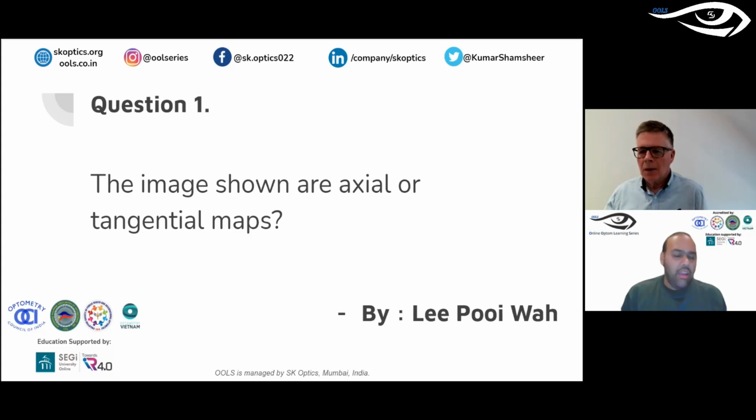Awesome. Great. And do you use tangential widely for all examinations, or do you switch between sometimes? No, I sometimes use the axial if we're trying to get a refractive situation out of, say, a low-grade keratoconus.